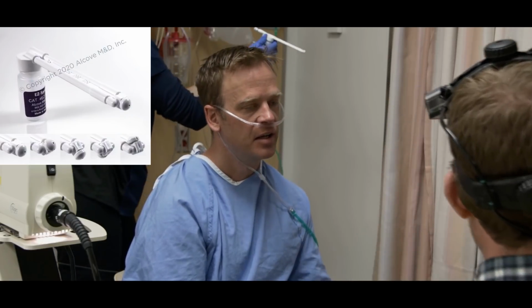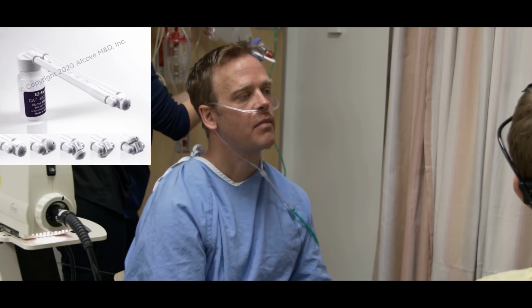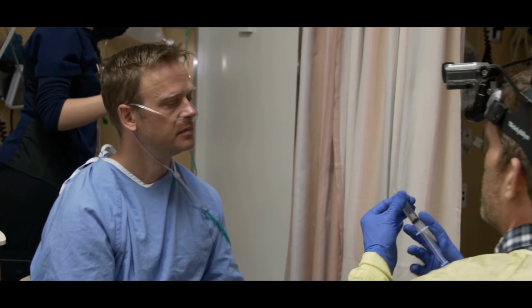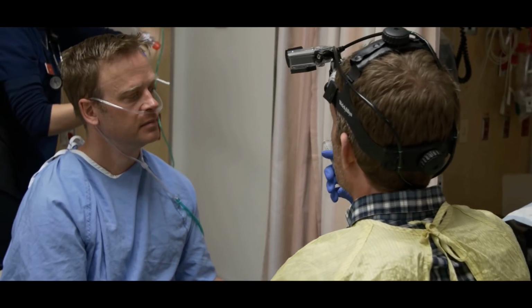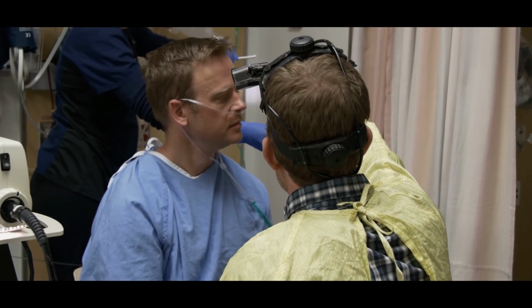Still not getting that back of the tongue. So I think I'm getting the uvula a little bit, so I'm going to spray the uvula next. And just open it up. We just have to open the lid there. And so we have 10 cc's of 4% lidocaine here, which is 400 milligrams of lidocaine. We're going to put that in there.